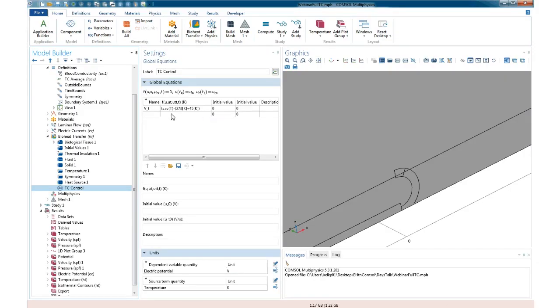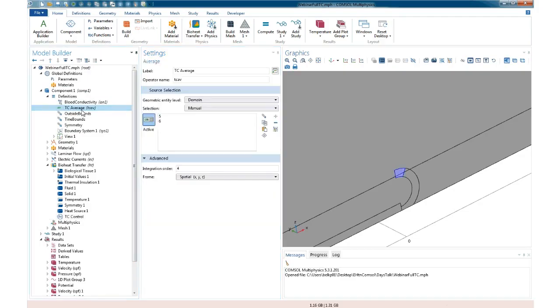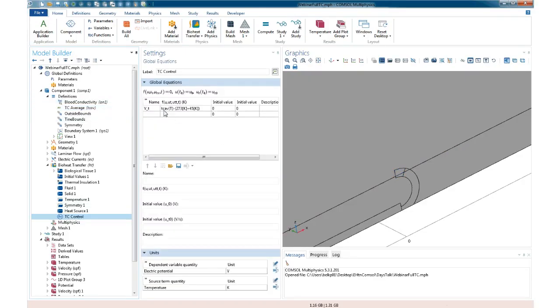Yeah. So there's two elements to this equation, separated by this minus sign here. The first element, TC_av of T, is what the simulator does for me when it uses this coupling here to take an average of some parameter. Now, when I created this average coupling across this region of geometry, it said, okay, I'll average anything I know. So I could average temperature, I could average voltage, I could average blood flow, even though there's no blood flow up here, anything. When I set up the equation, I said, okay, the thing I want you to average is temperature.